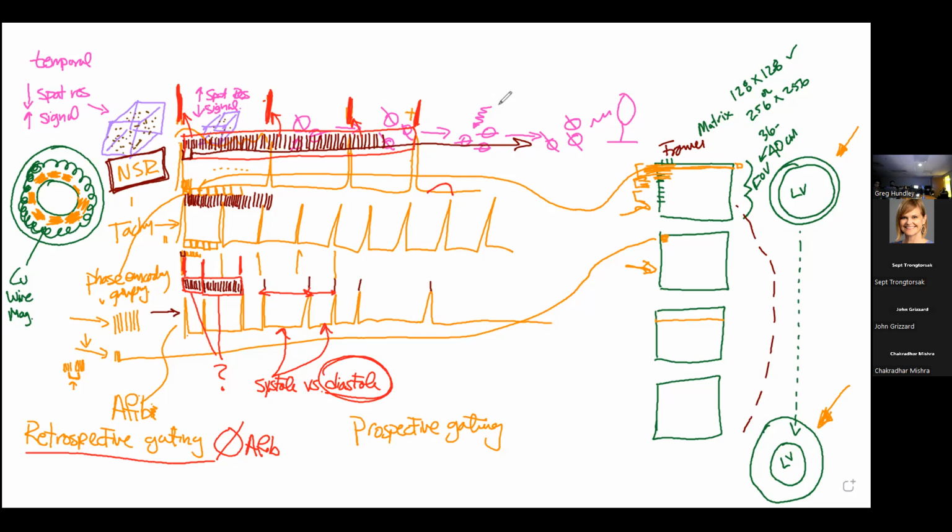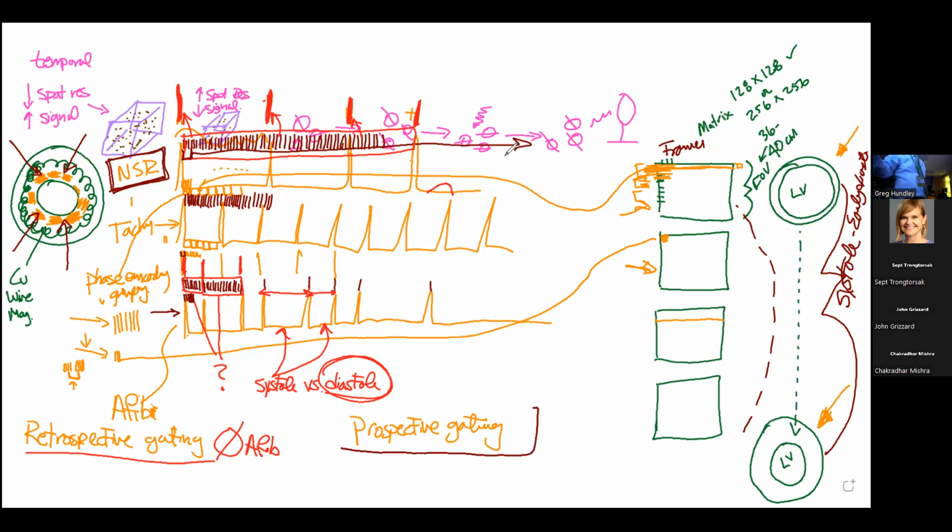So what you could do is, if we're at Virginia Tech, VCU, another academic center, or even a clinical center that's got a really nice magnet, we can change these guys really quickly and gather information very, very quickly, at 6 millisecond time intervals. And what we want to do to get that cine movie over here is image systole very consistently and only early diastole. And we switch to something called prospective gating.